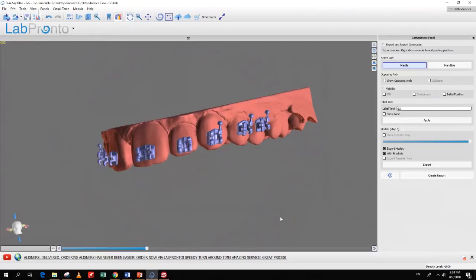So even in a situation where the plan has to be modified during the patient's treatment and you have to redo the planning with new models, the maximum that you're going to be paying for a particular arch or particular jaw is going to be one export, similar to fabricating a surgical guide. So again, that's irrelevant of the number of models you're exporting, and it's irrelevant of the number of aligners you're going to be exporting, or if you're creating an IBT or not.